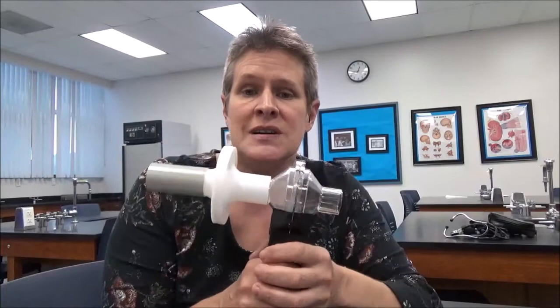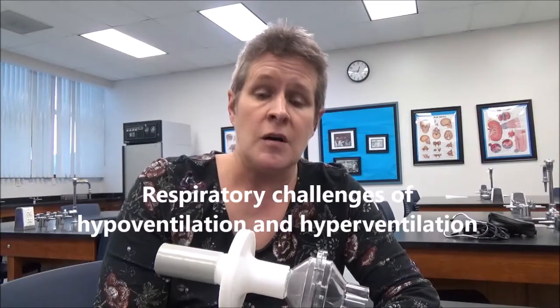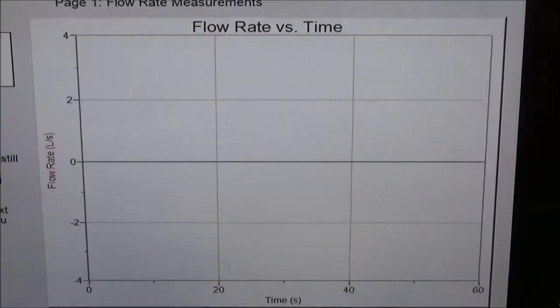So what we're going to do is take a normal spirometry reading and find out what lung volumes are, and then we're going to do a couple of respiratory challenges. So let's look at the computer. Okay, so we're going to start data collection.